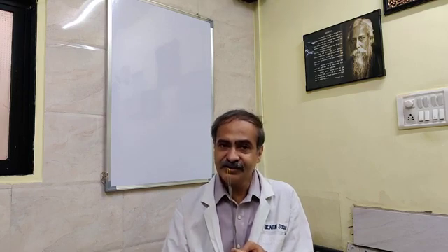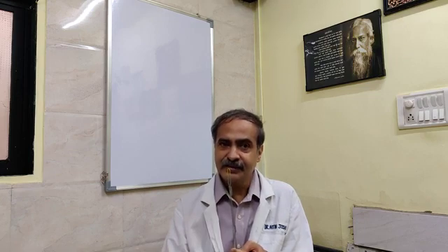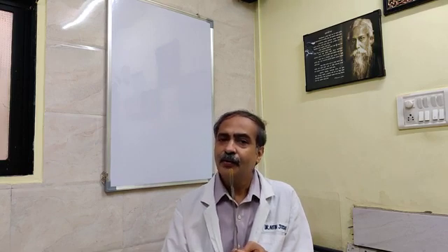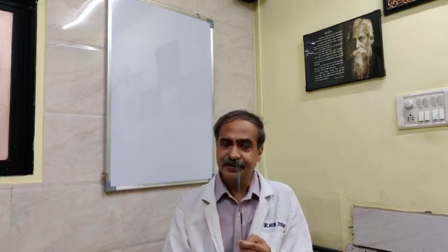At the end of the incision, because of incising the adenomatous tissue between the mucosa and the capsule, the bladder neck will spring open, and so even if the telescope is at veru, you can see the bladder cavity. Relatively, 6 o'clock position is avascular, so even if there are minor bleeders, they can be easily coagulated with the help of the hook itself. At the end of this, the fourth step of TURP is over. Thank you very much.